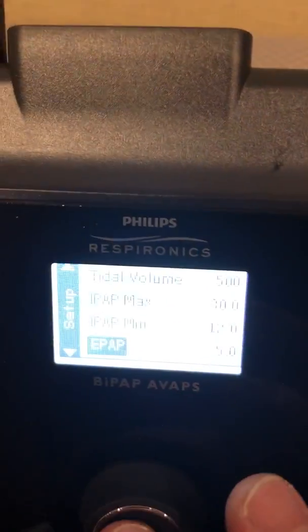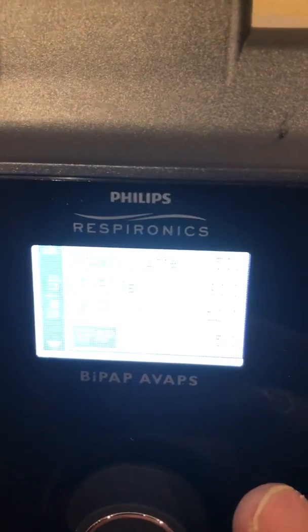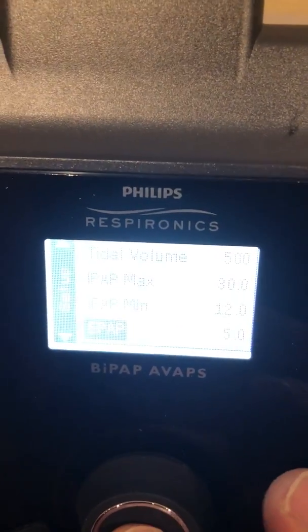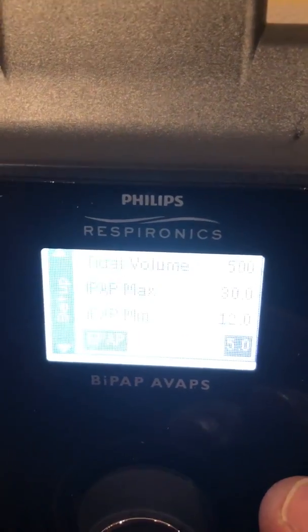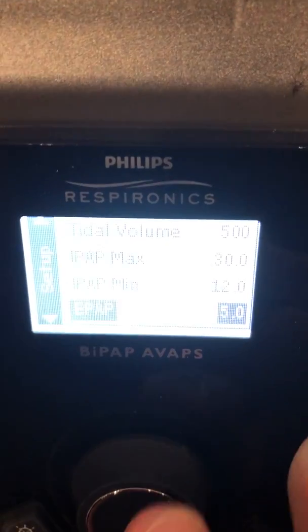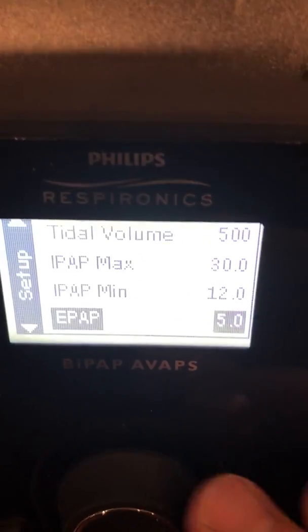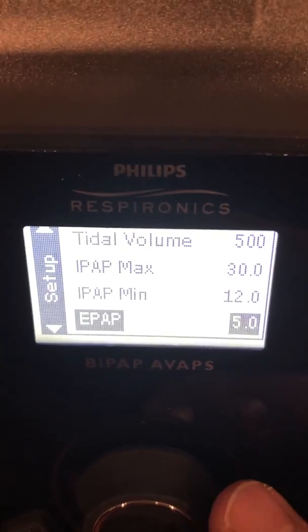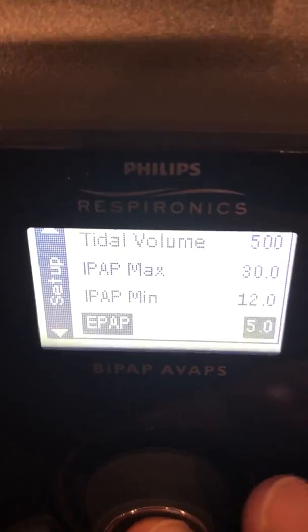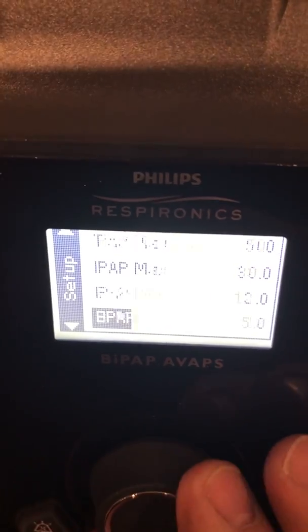Here's our EPAP. To make a change to the EPAP — which is the equivalent of PEEP — we will push the button. It toggles over to the number, we select it, and we can go up or down. We're going to keep it at 5, so I'm going to toggle back, select that, and that's fine.